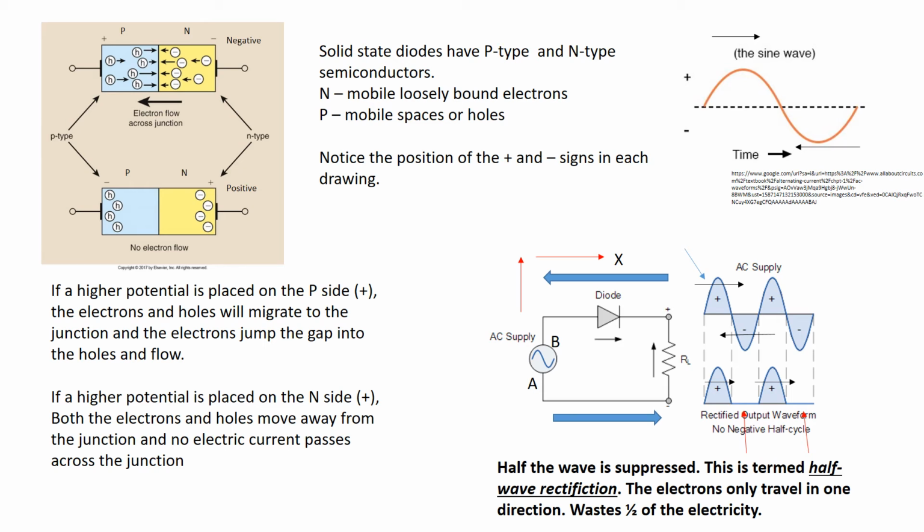So look at the bottom where the two cycles are drawn, and you've got your first hump. That would be going from A to B. Now what happens with alternating current? Then it switches, right? So now the electricity is going to want to flow from B to A. So the electrons start flowing from B. Look at the red arrows.